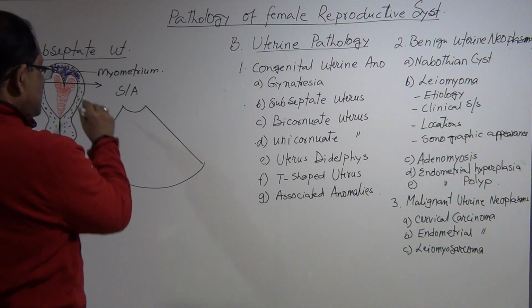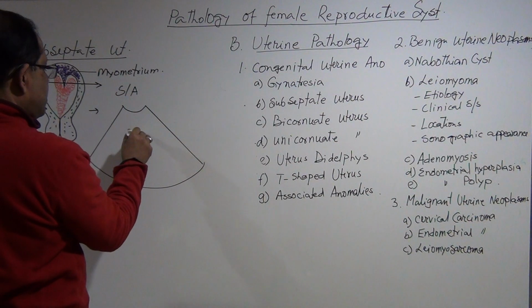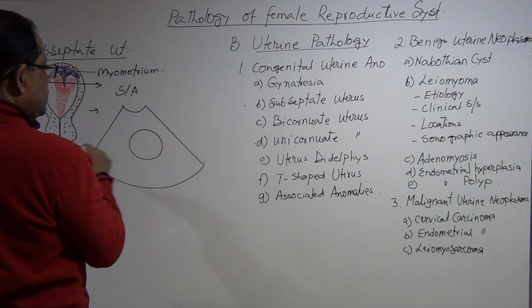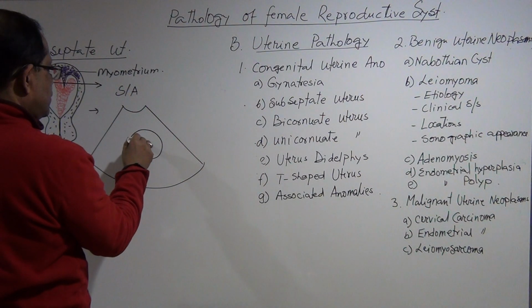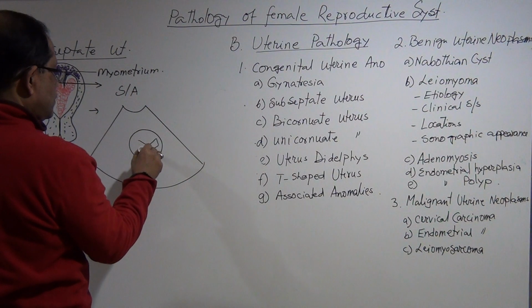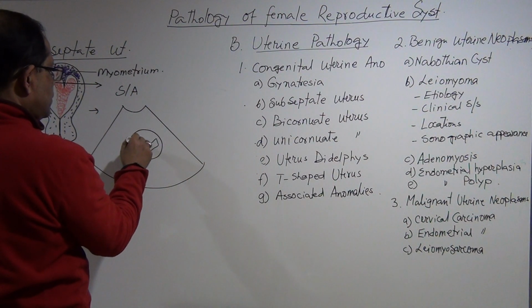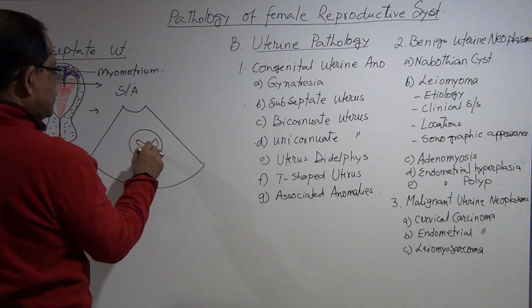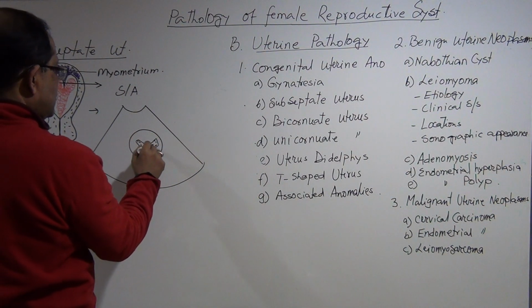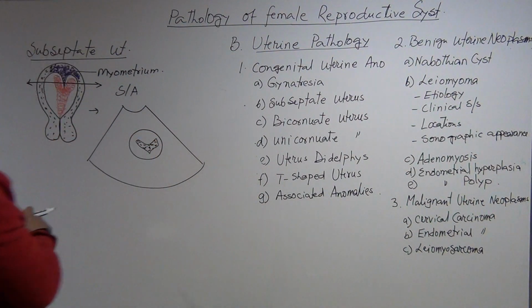In transverse view, look at the endometrium.